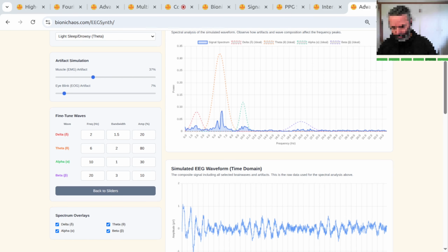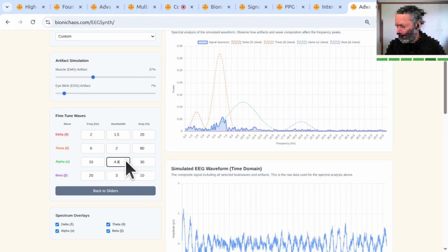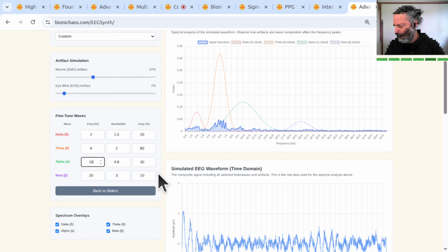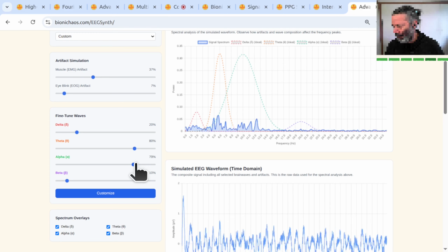So you can actually gauge emotional responses directly from brain activity. To a degree, yes. And monitoring critical brain states, think about assessing a pilot's alertness or drowsiness or tracking sedation depths during surgery. Advanced models using raw EEG are achieving very high accuracy there too, like 0.95 accuracy for sedation monitoring. That's crucial for safety. Absolutely. And finally, understanding motor control. We analyze how alpha and beta brainwaves change, that's ERD and ERS in sensorimotor areas, to see how the brain prepares and executes movements. It's incredible, really.